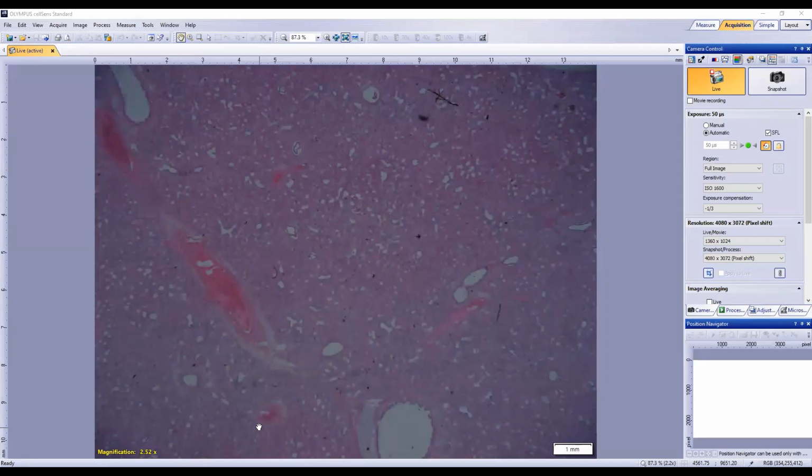So everyone, what kind of things can we rule out, or put lower down on the list at this power, or from what we've seen so far? Like neoplasia, you probably would maybe start ruling that one out. Yes, exactly.